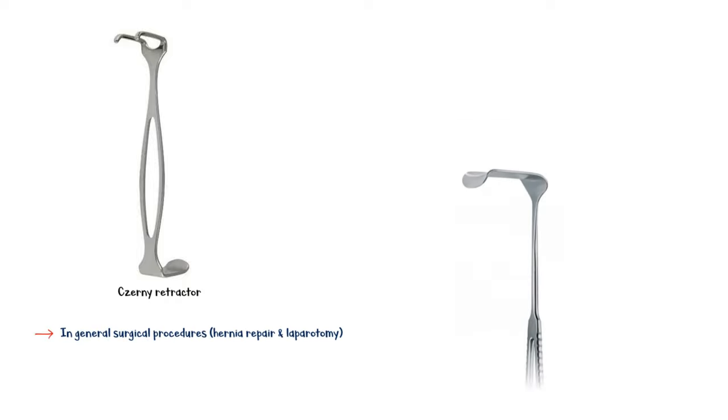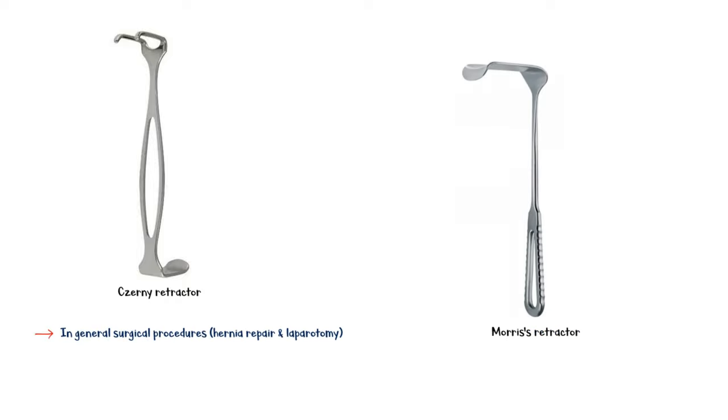Morris retractor, another commonly used one, is mainly used to retract abdominal wall incisions, loin incisions, and subcostal wounds.